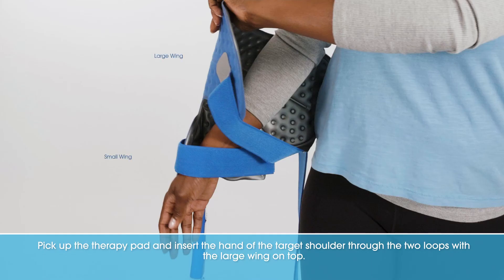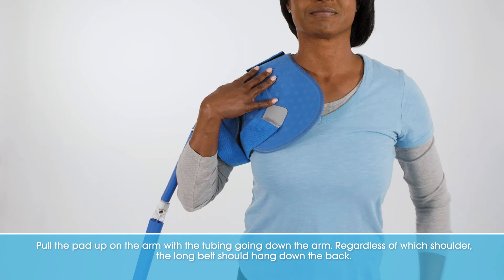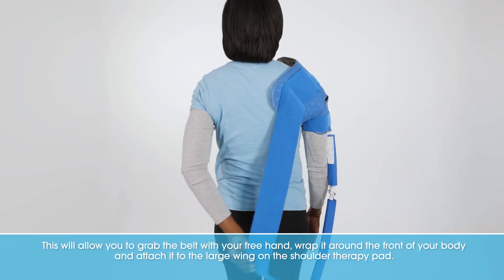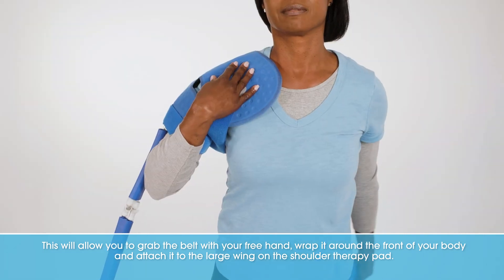Pick up the therapy pad and insert the hand of the target shoulder through the two loops with the large wing on top. Pull the pad up on the arm with the tubing going down the arm. Regardless of which shoulder, the long belt should hang down the back. This will allow you to grab the belt with your free hand, wrap it around the front of your body, and attach it to the large wing on the shoulder therapy pad.